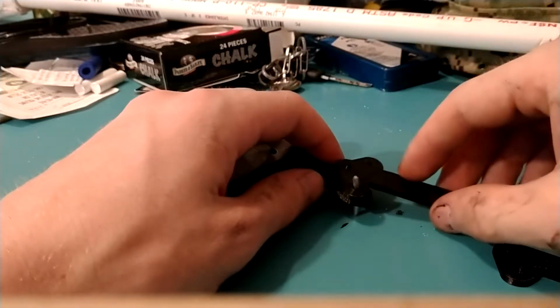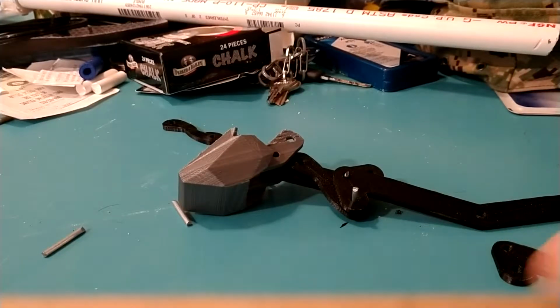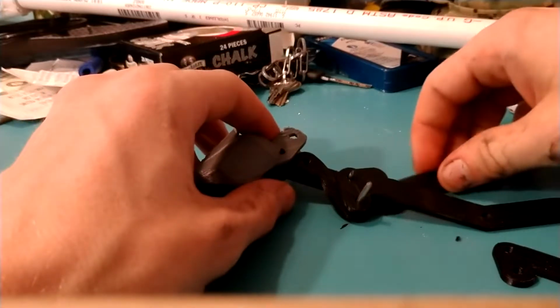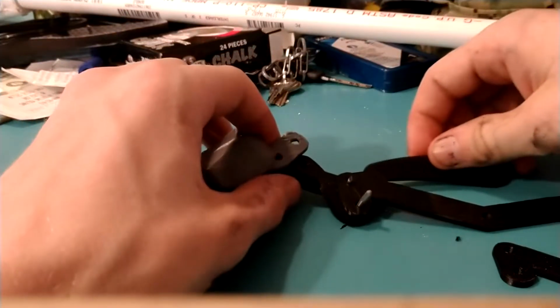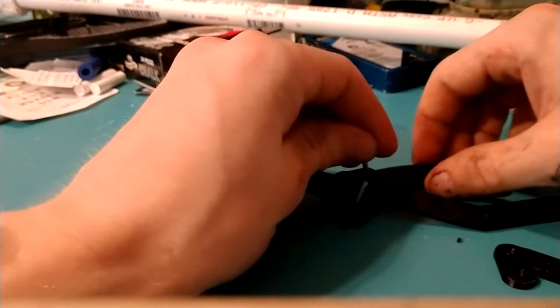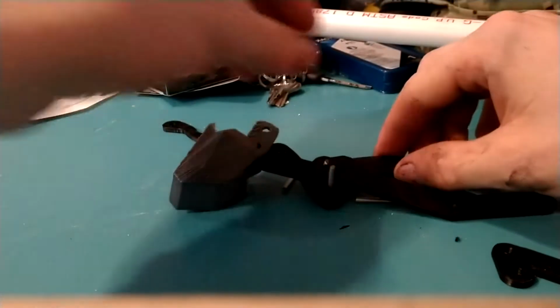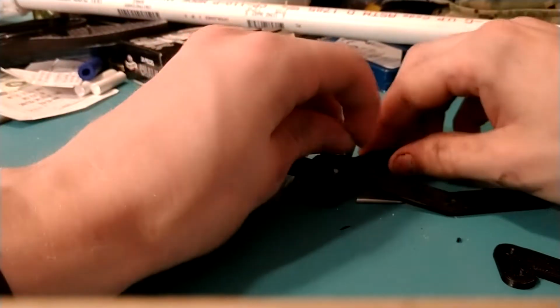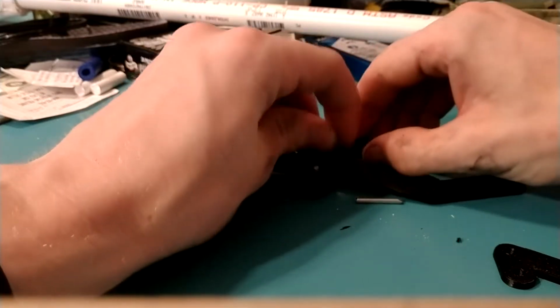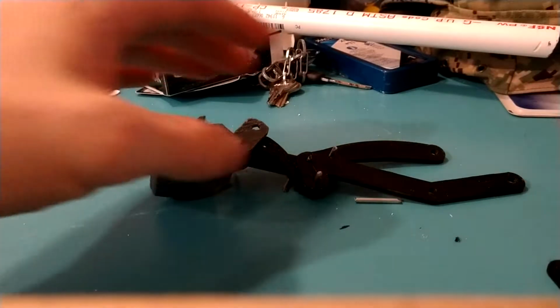So when you put that in, then this piece is going to go in between the notches on that midsection. It'll go in. There we go. And then this piece is going to connect the two.